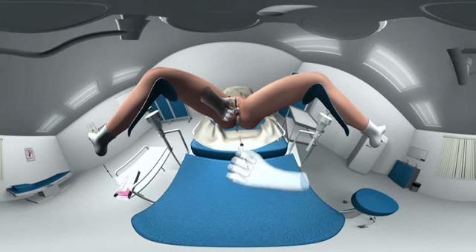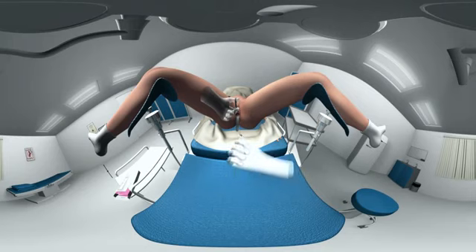Step 3. EMILY is now ready to be inserted. Gently advance the inserter tube into the uterine cavity until the flange meets the cervix and you feel fundal resistance. EMILY should now be in the desired fundal position.